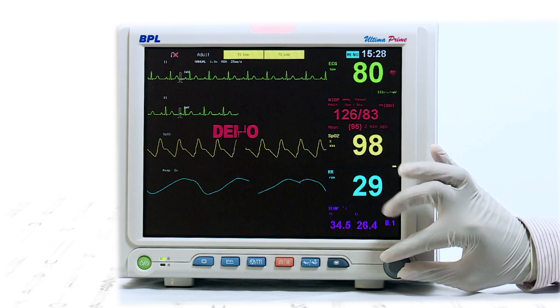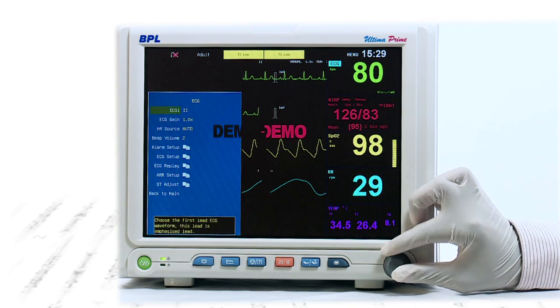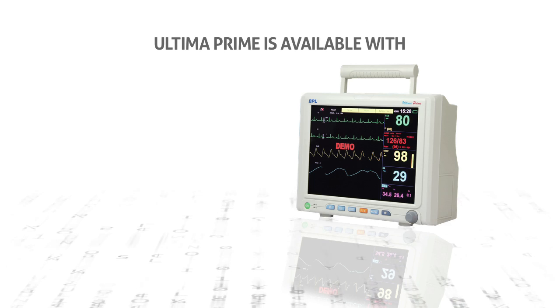Multi-coloured alarms, which are clearly visible from all directions, and rotary knobs with soft-touch keys ensure ease of operation for the user.